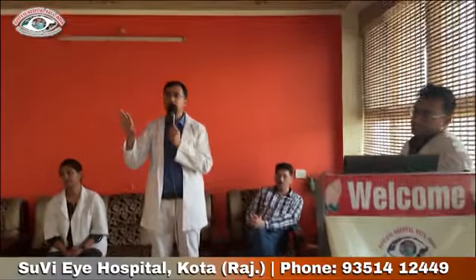So these are practical points for uncooperative patients, even pediatric patients, who may need GA, photophobic patients, patients sensitive to light. We can counsel them so that they become cooperative. All these things should be done: avoid heavy weight lifting post lasers.